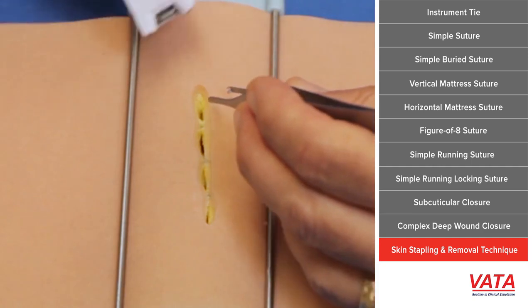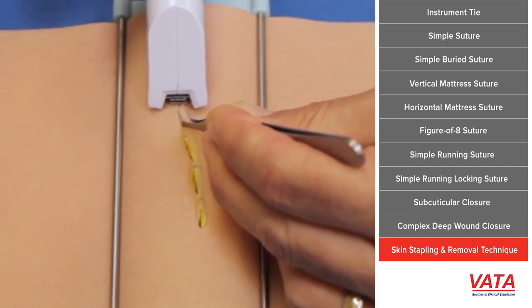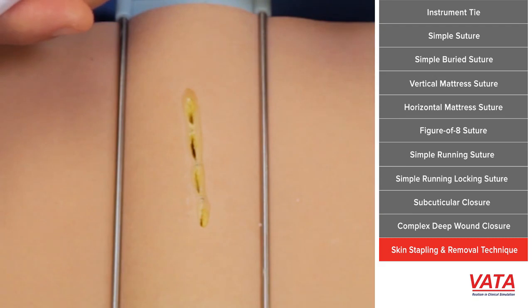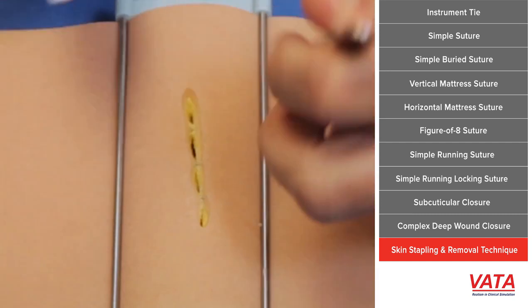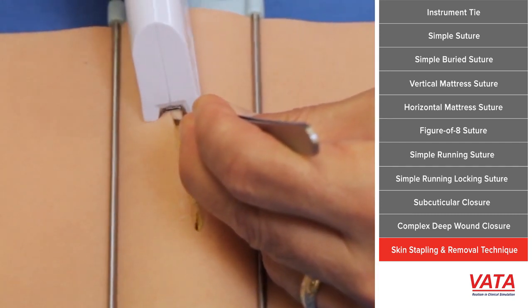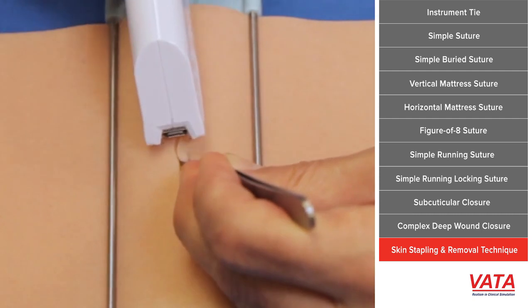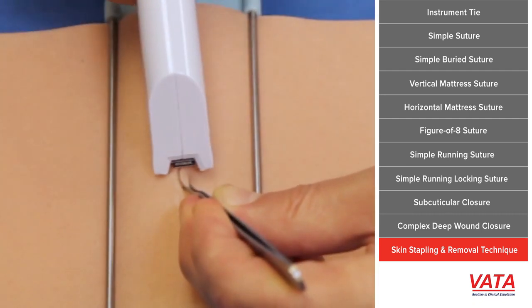Stapling is nice because it's fast and will turn the edges out. Here I'm approximating the skin, everting it, getting the skin edges close together so they're touching, and then placing the stapler. You don't need to push down very hard — a very controlled motion is key. The end of the stapler is not really moving at all. Try to grab it near the end for more torque advantage. Just like simple sutures, you have to decide how many staples you need and what each wound needs for approximation.